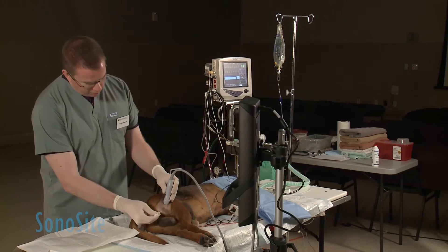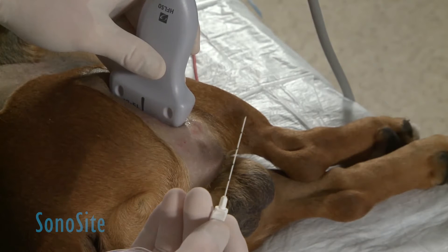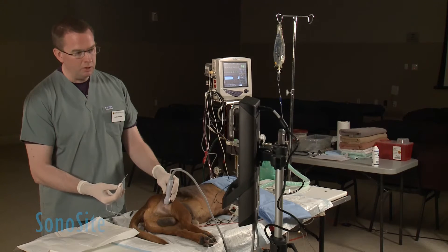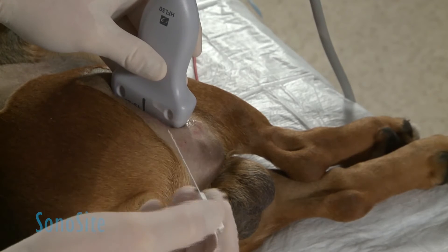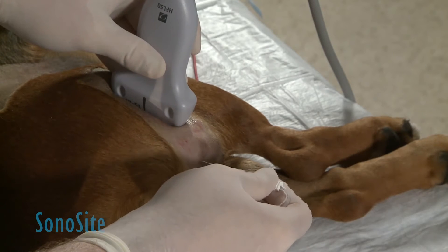We're going to place the needle — we're using an insulated regional anesthesia needle, which allows us to also assess the identity of the target nerve by using a low electrical current to stimulate the motor component of the nerve. When we do so, we will see some extension and then flexion of the tarsal joint distally.